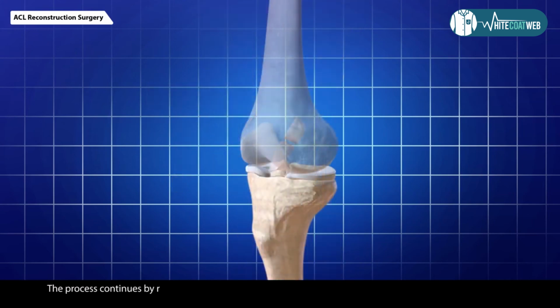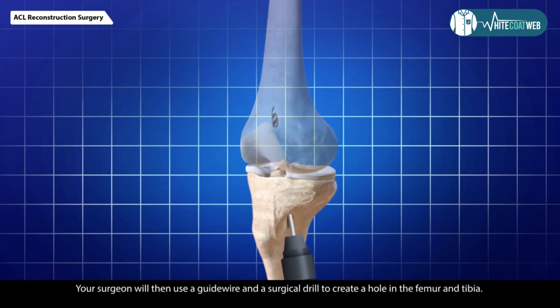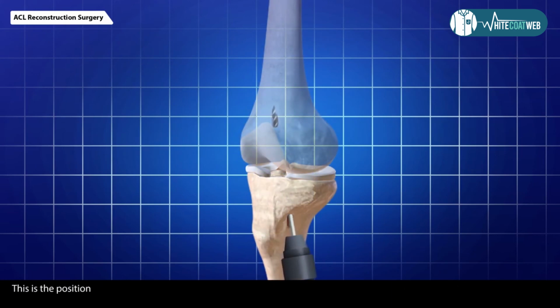The process continues by removing the torn ACL and any other debris from where the ligament was attached. Your surgeon will then use a guide wire and a surgical drill to create a hole in the femur and tibia. This is the position where the graft will be anchored.